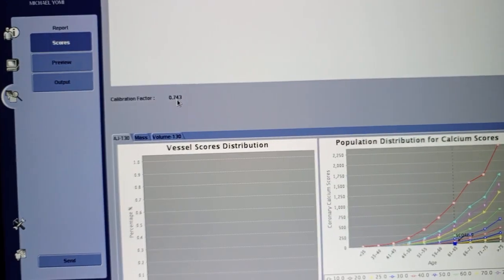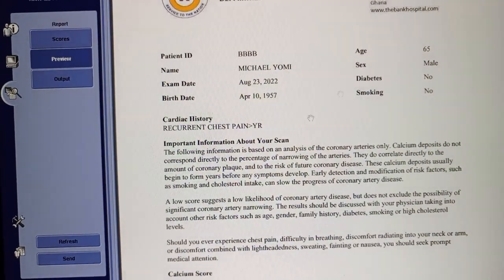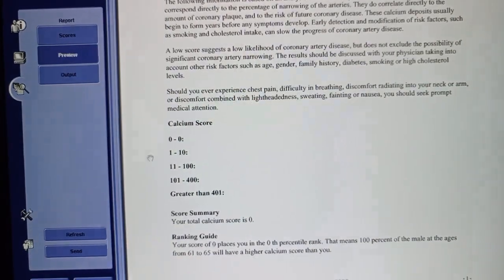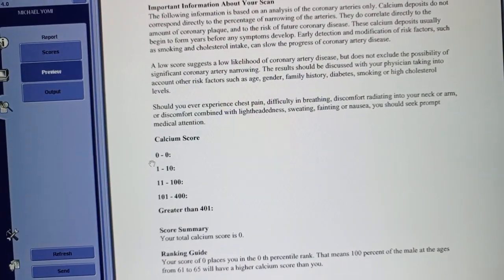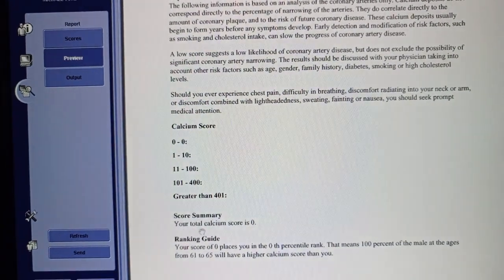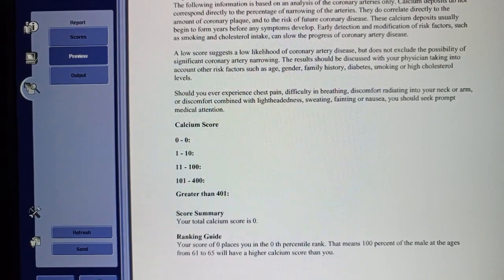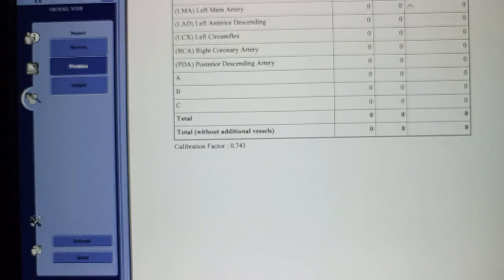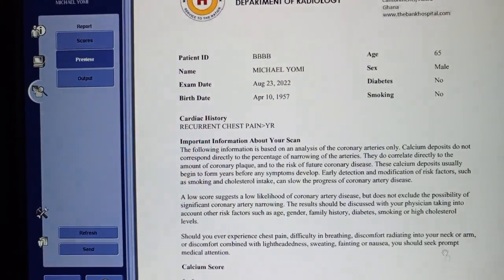Let's go to the report preview. It uses a calibration factor of 0.743. The report is automatically generated. The total Agatston score is zero, and it has a table — if there were any calcifications in any vessel, it would have generated all the details for us.